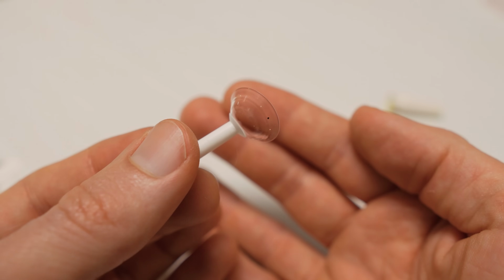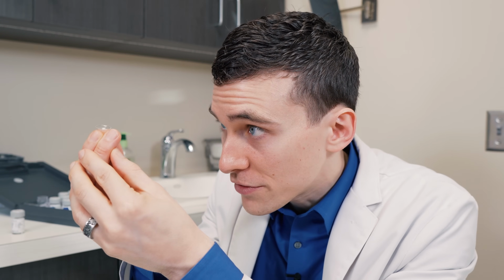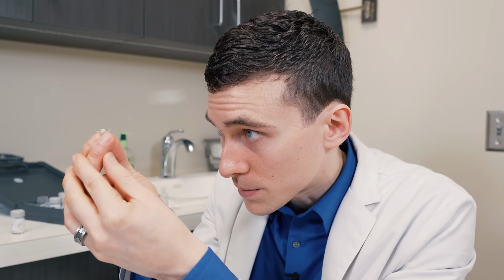If you do ever mix up your lenses, some brands do have little laser markings on them, including little dots that'll tell you which eye belongs to which. Usually there's one dot for the right eye, and sometimes you'll see two dots for the left eye. But ultimately, if you do mix them up and you're not sure, contact your eye clinic for help. Now, when you remove the lens, you want to inspect it to make sure there's no defects, no chips, or any other problems.